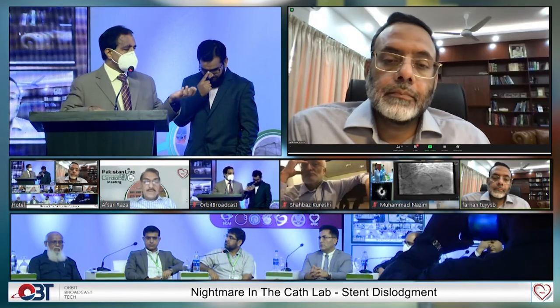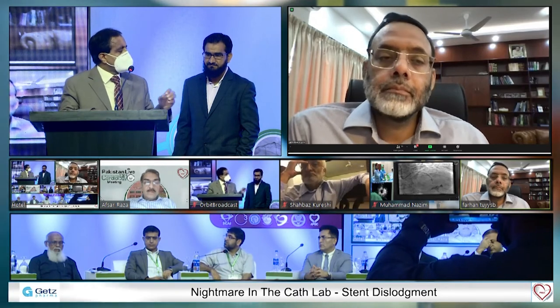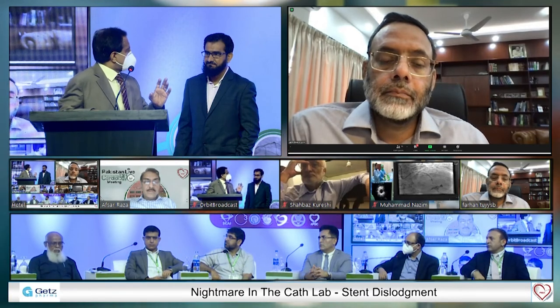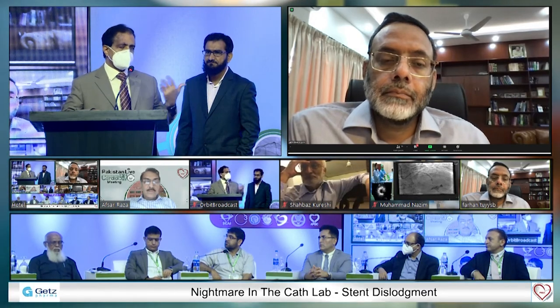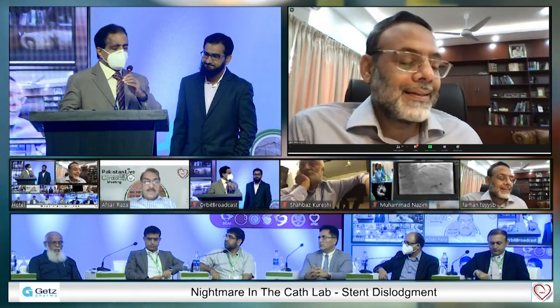Another thing you can do: if your balloon doesn't go distal, whatever balloon goes in, inflate it there with a 1.5 balloon, then take a bigger balloon and deploy the stent over there. Then you may be able to take the other stent down quicker. But great case, you were able to get it out and didn't get into trouble. So that's good. Thank you very much.